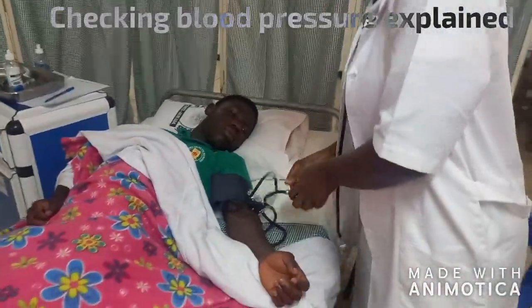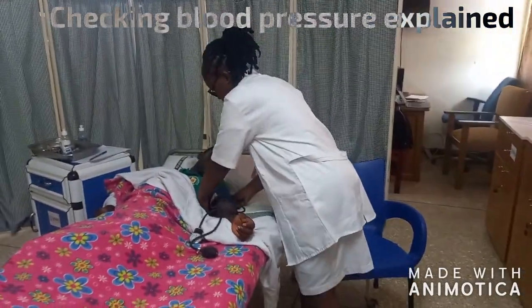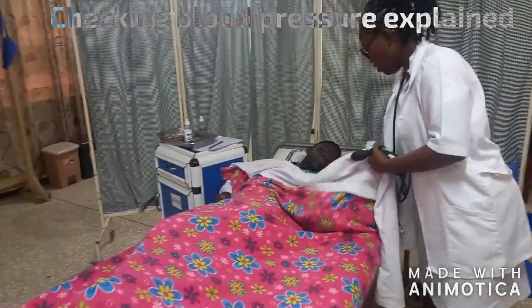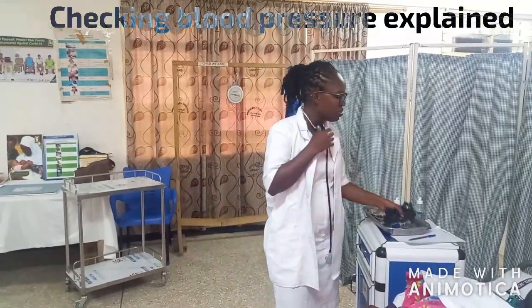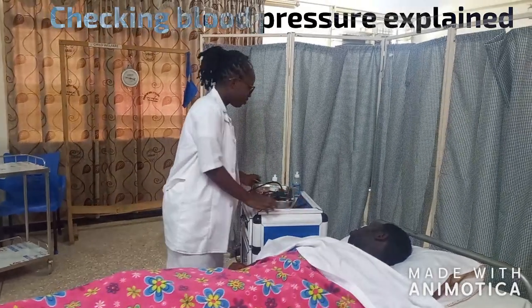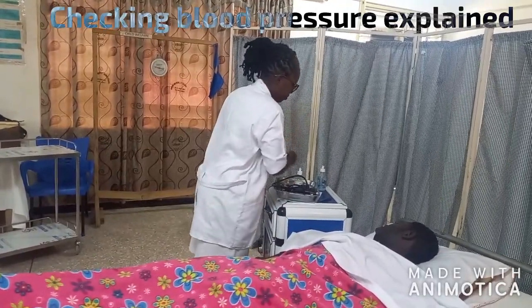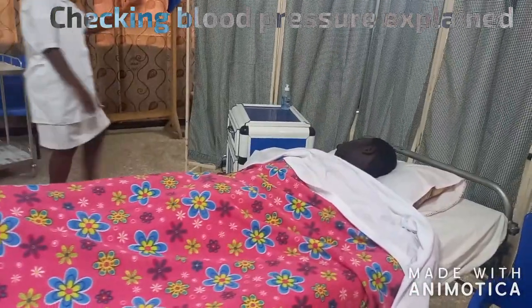When you are done, take it out gently. You remove the cuff, powerfully holding it, rolling it nicely. You put it in its case — it must be in its case before you put it away. Then you tell the patient about the values that you had, like: 'Your BP is 120 over 70, which is very normal for your age, so there's nothing to worry about.' So you clear your items. After clearing your items, you sit down to record all the findings and chart. And you're done with it.